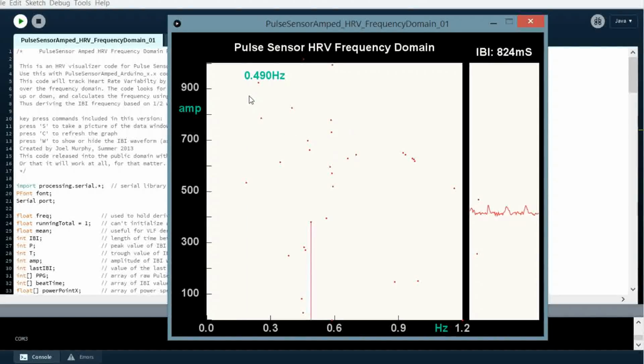My graph, I took the same sort of data, but I constrained everything to keep it inside the window. So anyways, I just wanted to give you an idea of how I used someone else's code. Basically, I believe it's the company that makes this little sensor. It's their code. And I took it and made my own application, which in my opinion, works better.